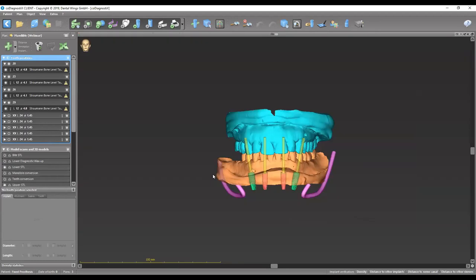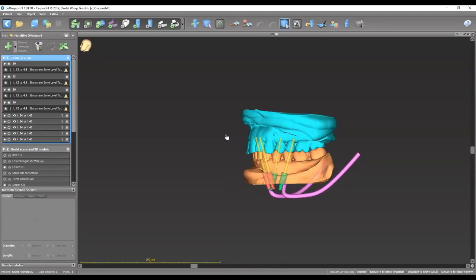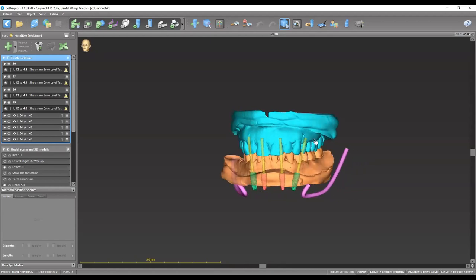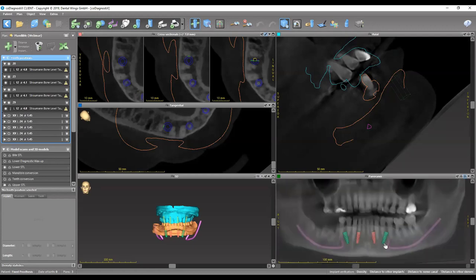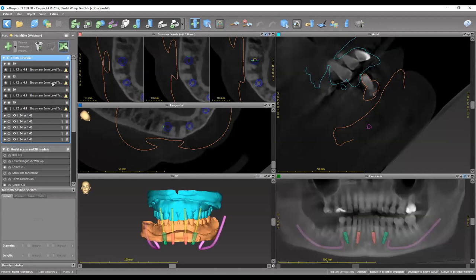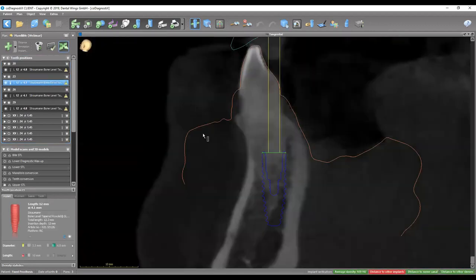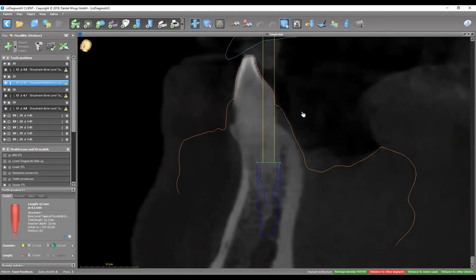We've chosen to place four implants on the bottom — an all-on-four approach. Since the patient has dentition, we took a CT scan and recorded the anatomy by taking impressions or intraoral scans. We took the arch of interest, the opposing, and the bite. You can see that the patient's upper and lower models are articulated virtually because of the bite we imported into the software. Starting with number 23 — a 4.1 by 12 Straumann implant.